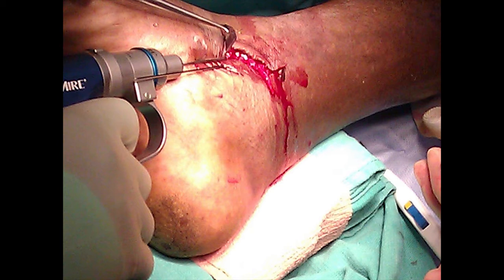Now your key is to get that K-wire or that guide wire up the fibular canal. And so this is the hardest part. If there was anything difficult about this, this would be the most difficult, because you're going to get that aligned. It is what takes the most time. So if you can nail it first time, you're really done. This is 20 minutes, 30 minutes in surgery.